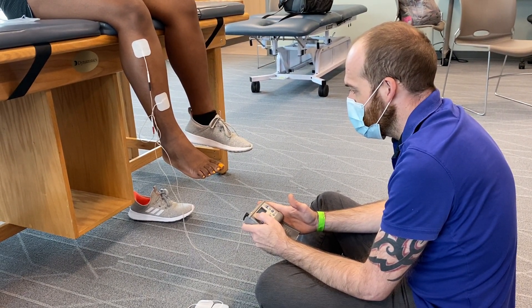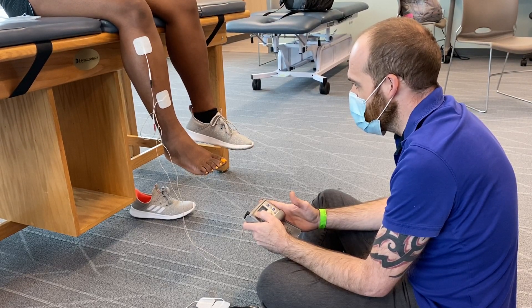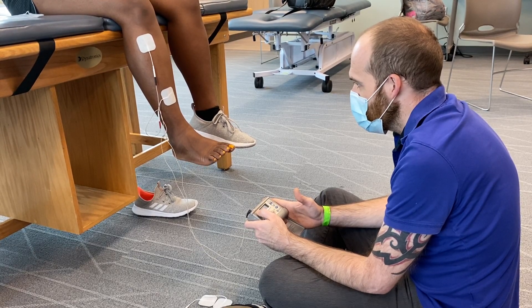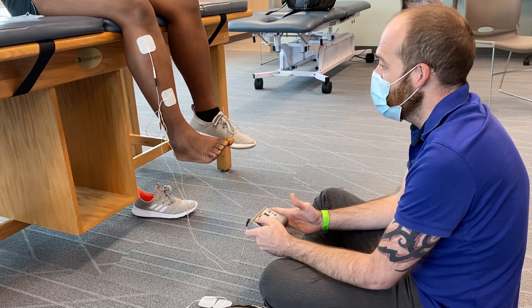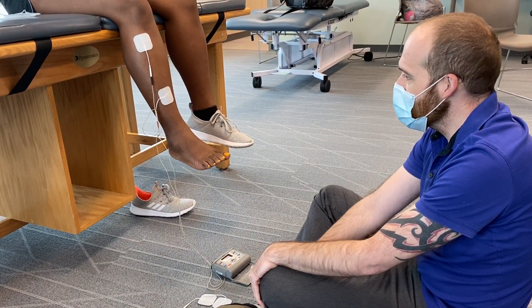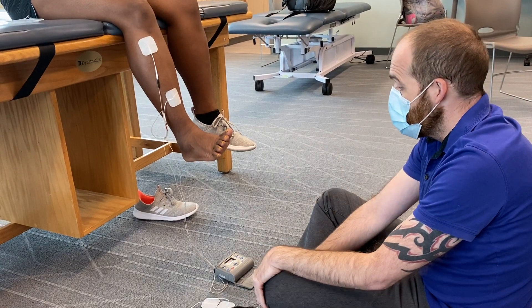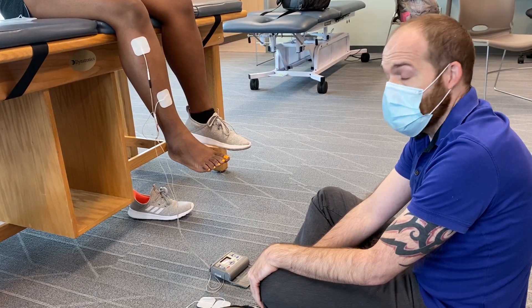We're at 12 — that's usually where you start to feel it. Her ankle is moving. That's dorsiflexion with just a little bit of inversion, barely. Now I would ask Ola: every time you feel the machine come on, contract with it. And when it goes off, you can relax. And that's it.